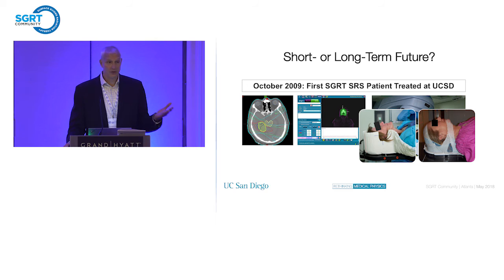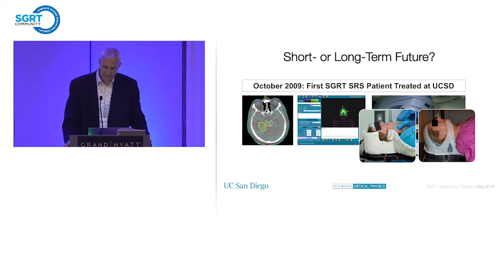And I think we've heard throughout the conference here that the more you try to make somebody immobilized, the more they're going to be uncomfortable, the more they're going to move. There's a lot of qualitative experience around that idea, so I don't think that's anything new.